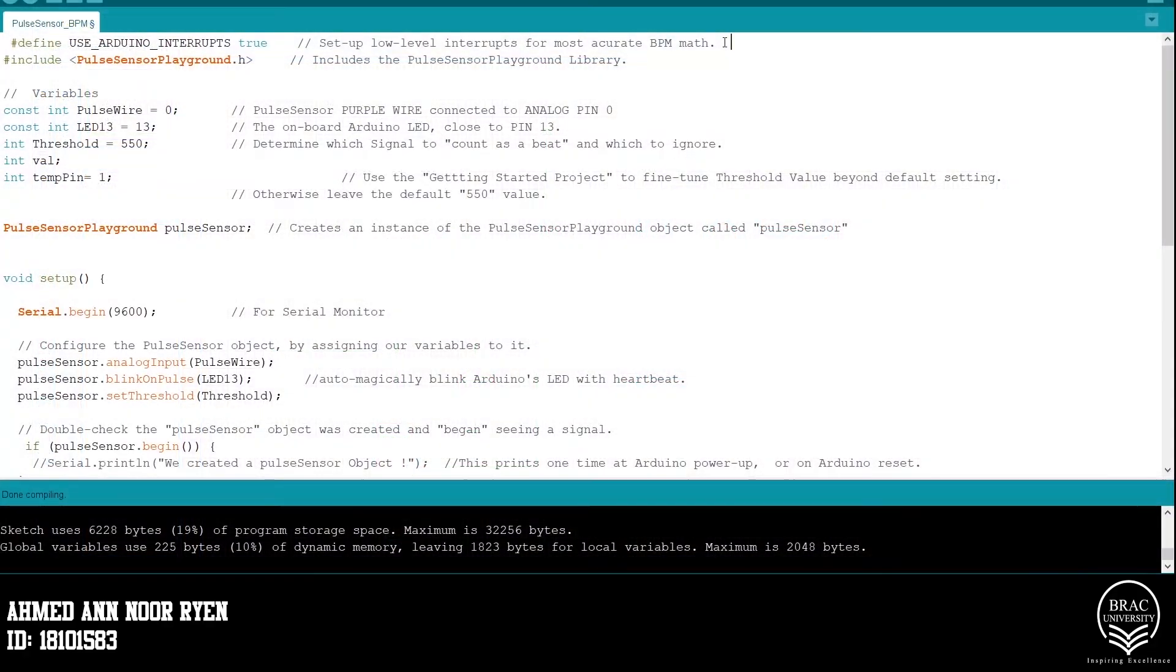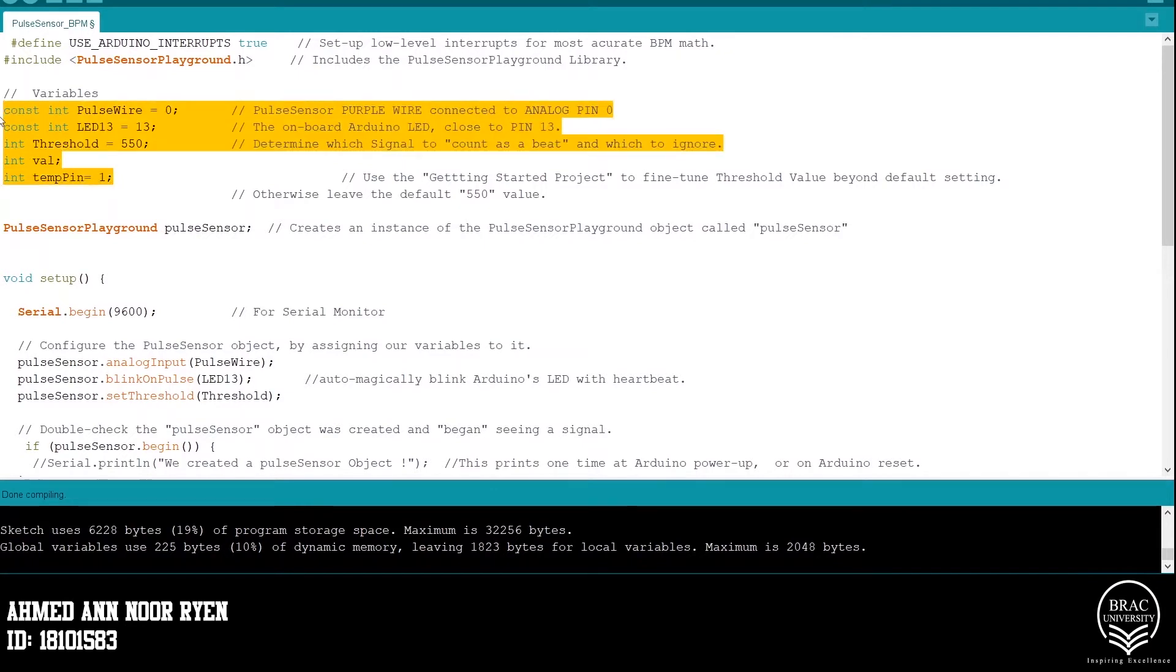Hello there, I'm Ahmed Anurain. In the firmware code, firstly we define all the variables which are pulse wire, LED 13, threshold, and the temperature pin.